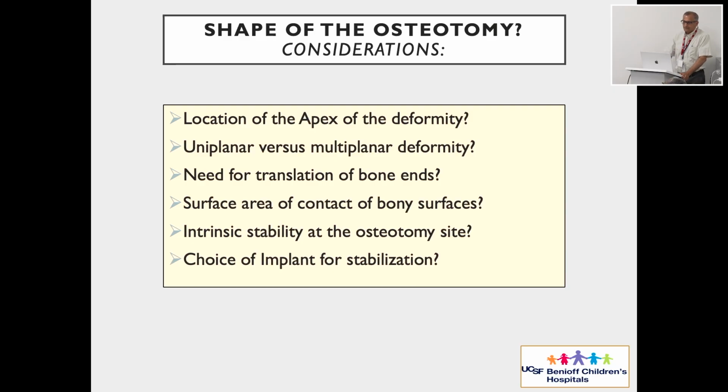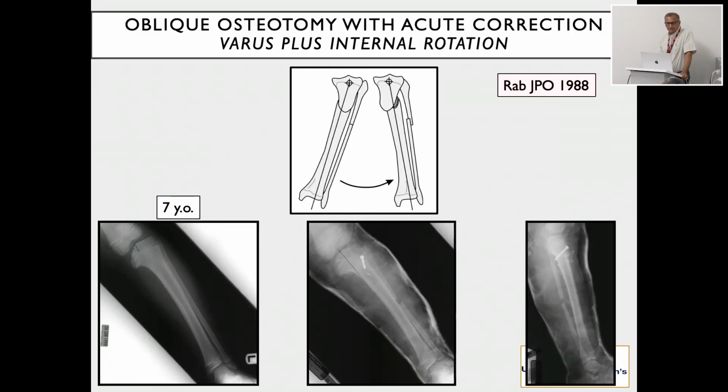Shape of the osteotomies, again, you could go into all the details, but I think I'll give you a few examples. Like, you can do a biplanar correction just by the tilt of your cut, right? So here we're talking about a sagittal saw blade cut in an acute situation, which I guess you can do sometimes, which is an oblique plane cut.